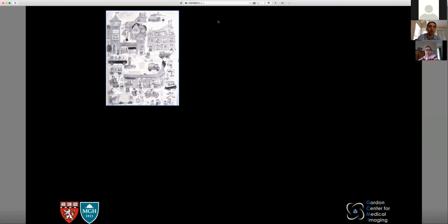It is there because it provides us also with information about the attenuation distribution and the anatomical localization. So it's very important to remember the anatomical localization because PET, as we discussed in our first lecture, is a very sensitive modality, but it does not have a high spatial resolution. So that means that localization is very hard on PET.